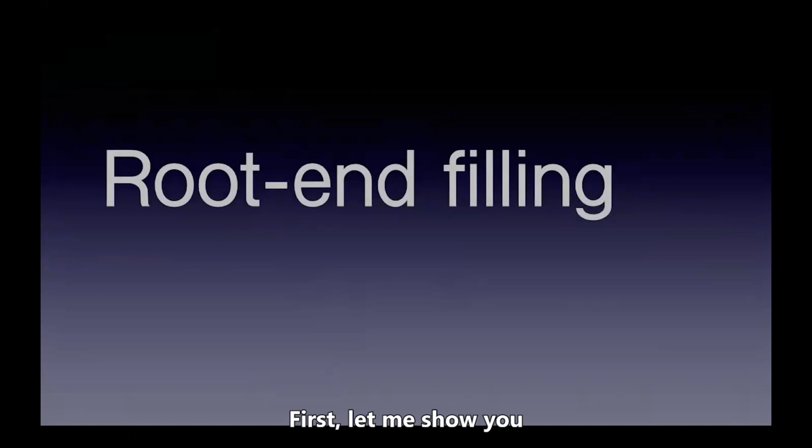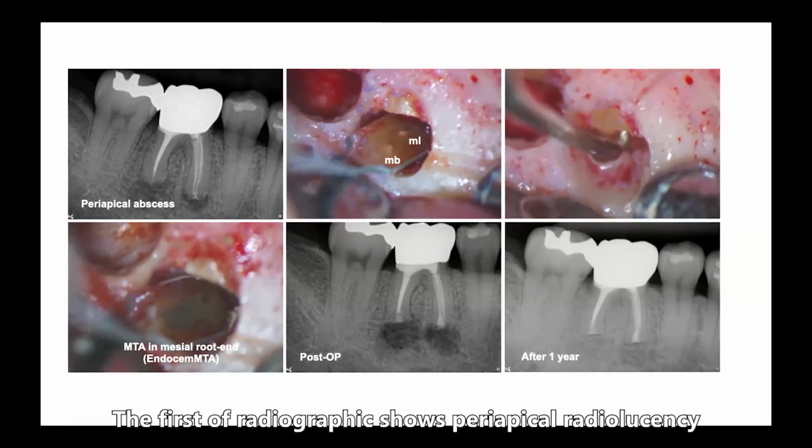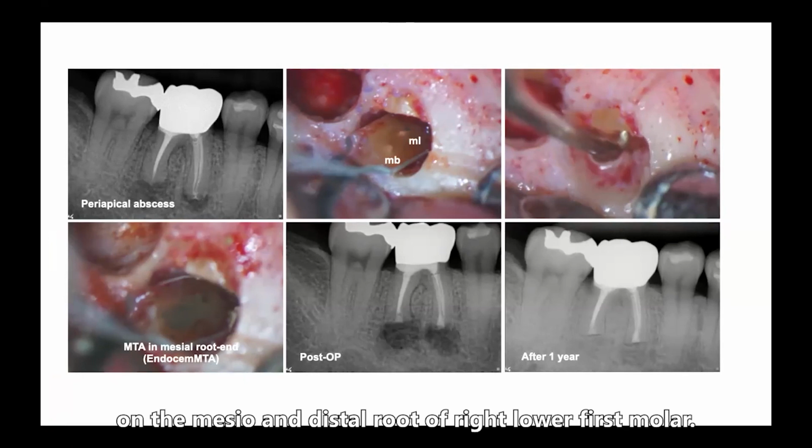First, let me show you a couple of clinical cases of root end filling during periapical surgery. The patient complained of persistent pain, and a sinus tract was found even after non-surgical endodontic treatment. The first radiograph shows periapical radiolucencies on the mesial and distal root of the right lower first molar, even though the root canal status is very good.